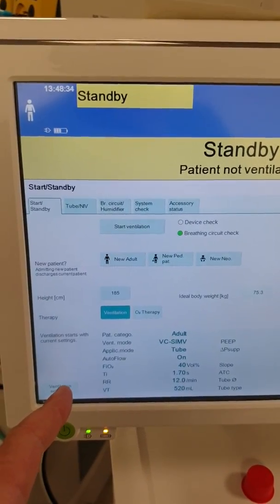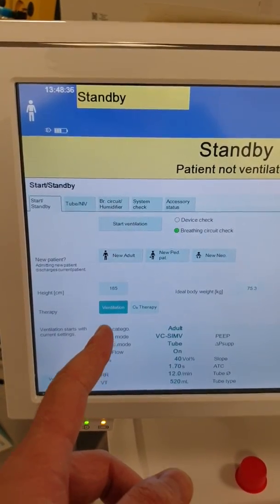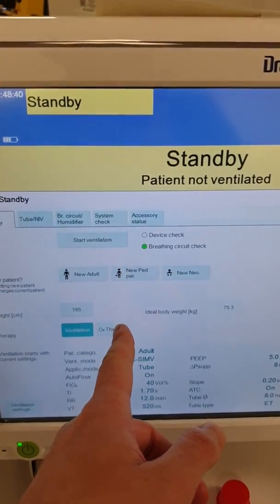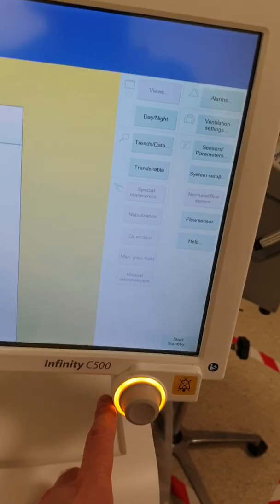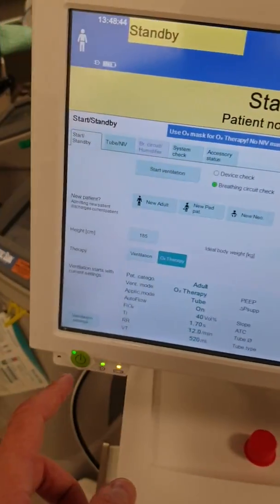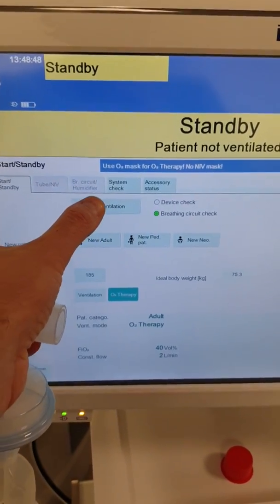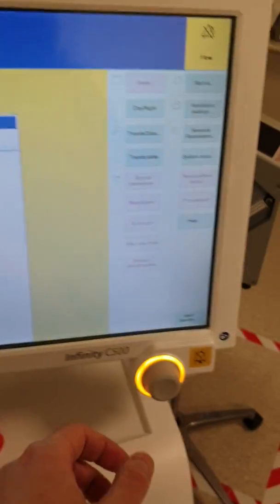So this ventilator can do high flow as well. If you want to switch from normal ventilation to high flow oxygen, you press over here and confirm. Then if you want to start, you press start and confirm again.